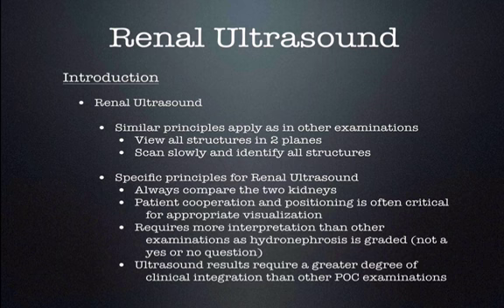Similar to the other exams you will perform, you want to view the kidney in two planes, scanning slowly to identify major structures. Always compare the two kidneys to each other, even when no abnormal pathology is initially appreciated. Compared to many of the other point-of-care examinations, the renal exam requires more clinical interpretation, mainly because hydronephrosis is graded and not a simple yes or no binary question, thus leading to a higher degree of clinical integration as well.